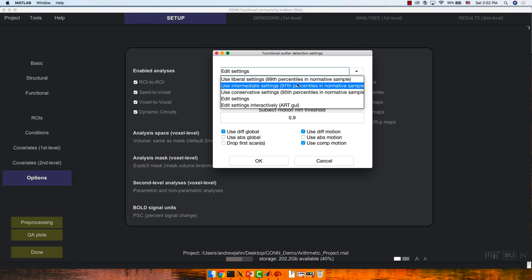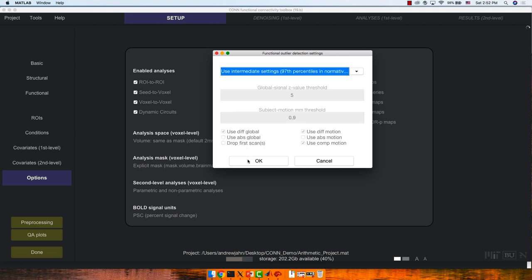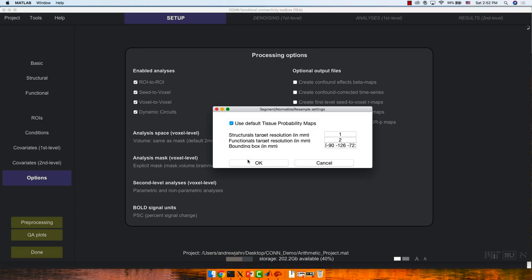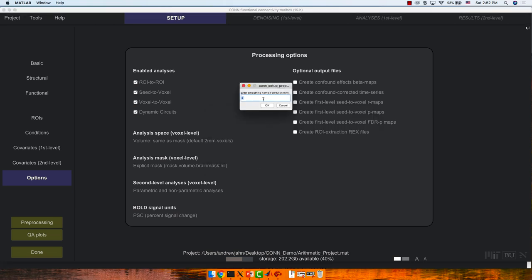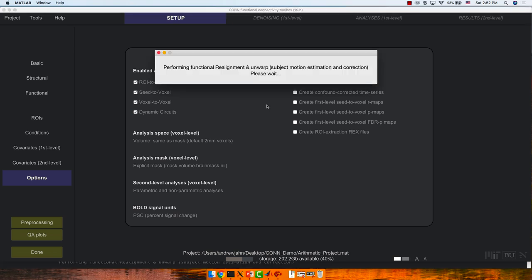The intermediate default settings work pretty well. The resolution for the output functional is two-by-two-by-two millimeters — pretty good. You don't gain spatial resolution by making it any smaller; it simply divides the signal into smaller bits. Two or three millimeters is fine. The last thing is the smoothing kernel, which defaults to eight. So now preprocessing should be starting on your machines, and we're going to leave that while I talk a bit more about these steps.